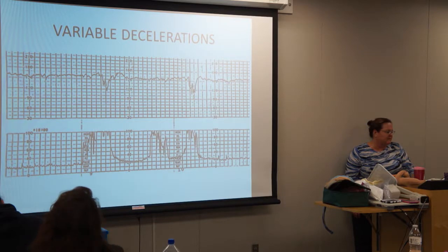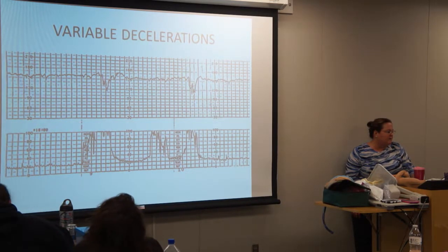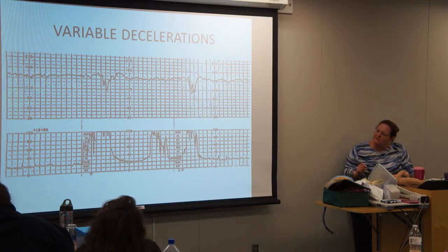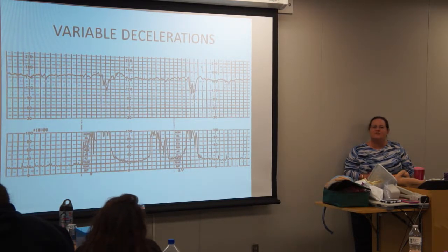Okay, so here are some lovely V's. Now, if you look at the fetal heart part, you can see the V's for the variables. These may not be as concerning, and we may not do something, because look at the contractions on the bottom. You see those big plateaus? Does anybody know what the plateaus are? She's pushing. That's usually what the EFM will look like when they're pushing. They get these plateaus kind of flat across the top during that time.